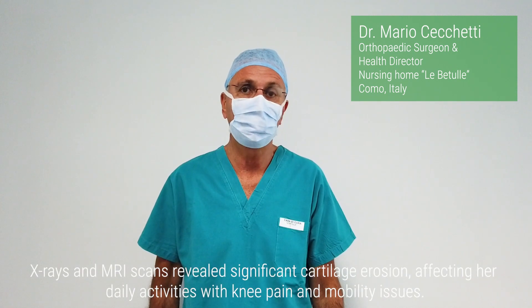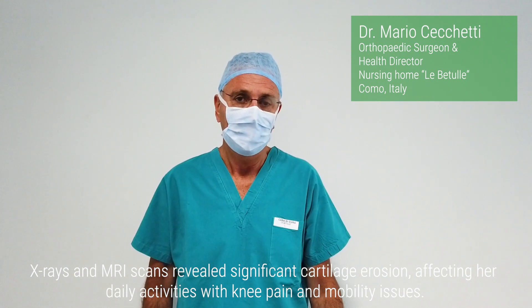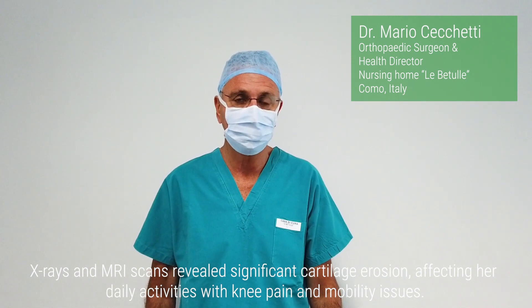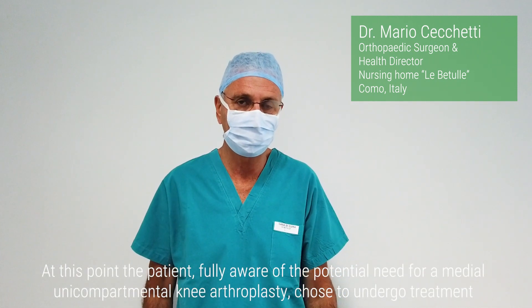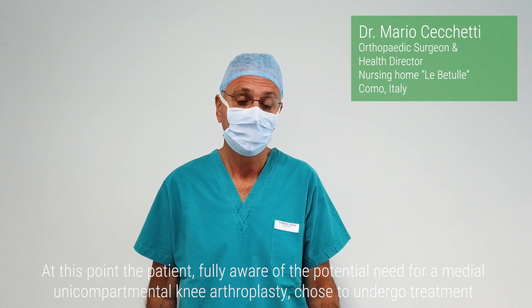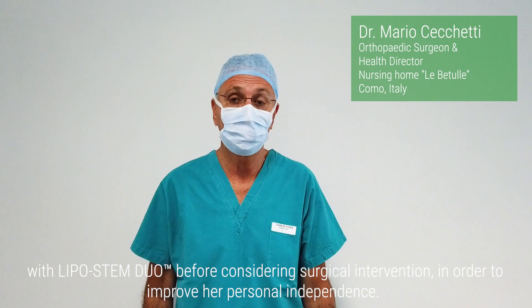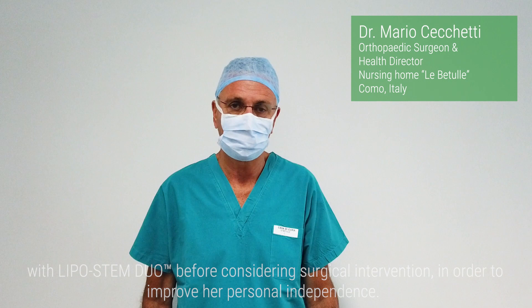X-rays and MRI scans revealed significant cartilage erosion, affecting her daily activities with knee pain and mobility issues. At this point, the patient, fully aware of the potential need for a medial unicompartmental knee arthroplasty, chose to undergo treatment with Lipostem Duo before considering surgical intervention, in order to improve her personal independence.